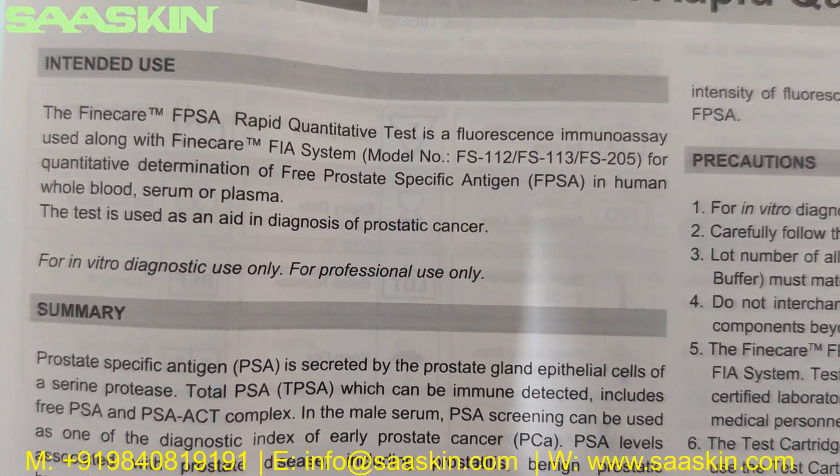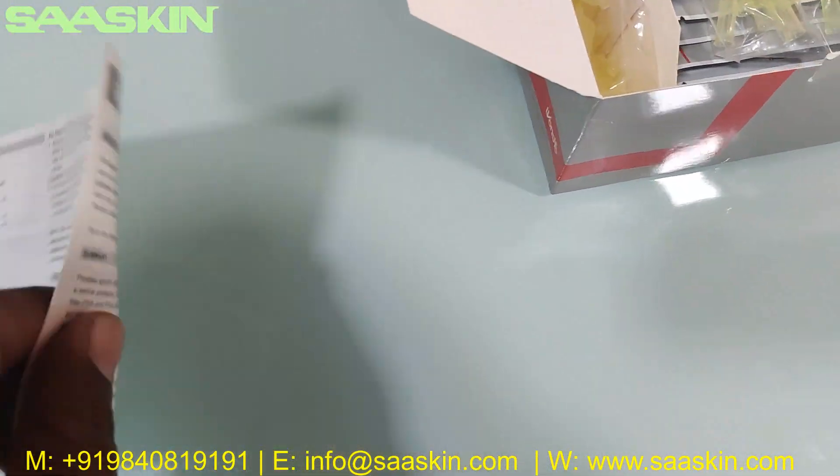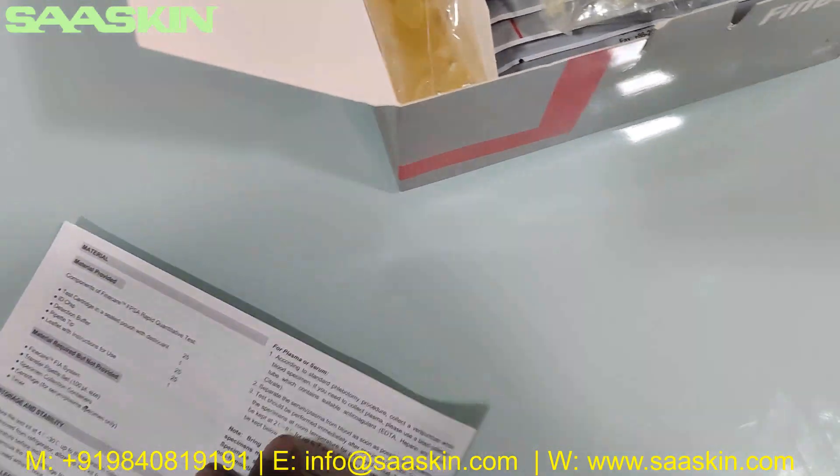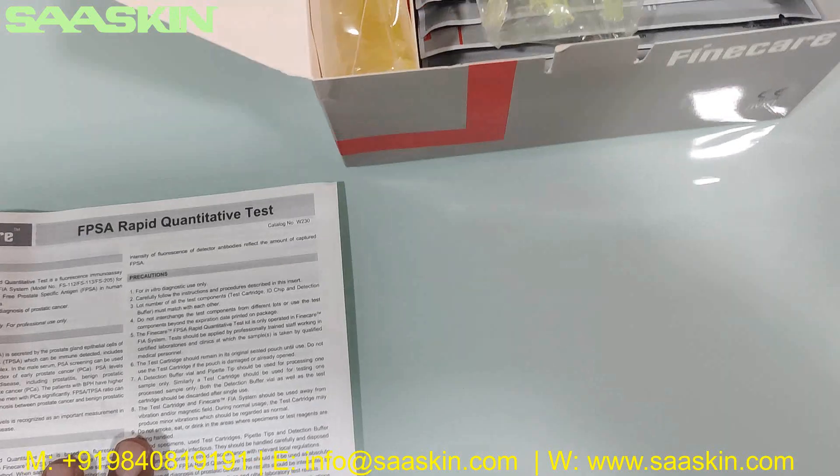This test is used as an aid in diagnosis of prostate cancer. You can see this is the instruction for use manual. It has complete details about how to conduct the test and how to interpret the results.